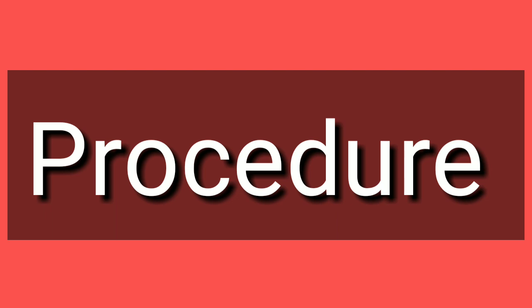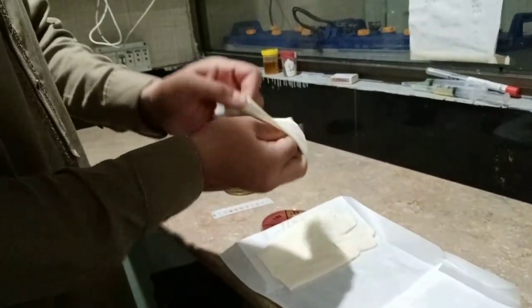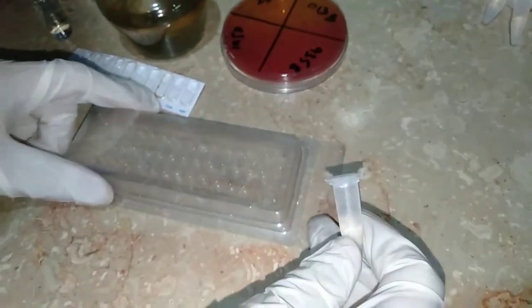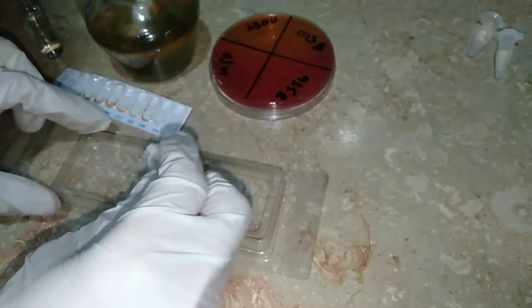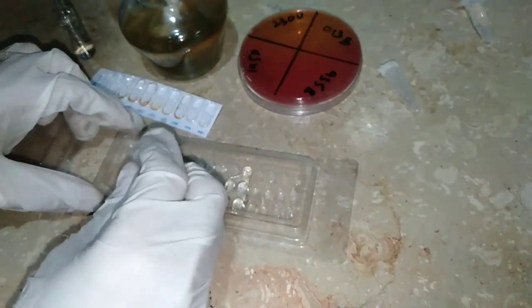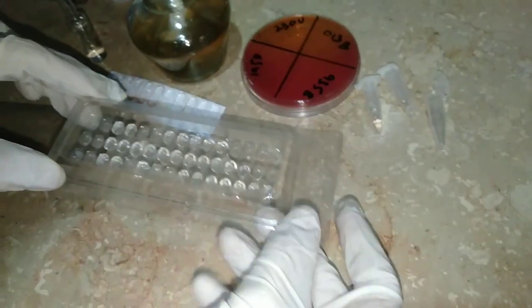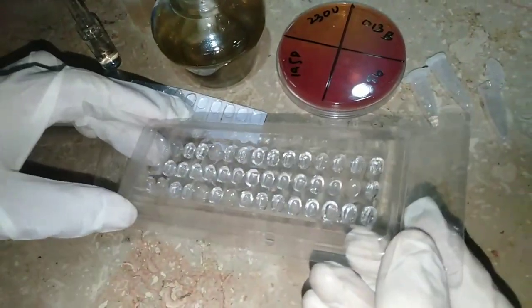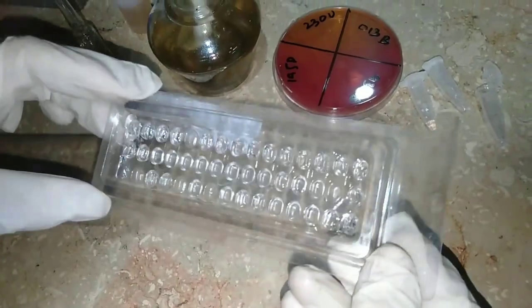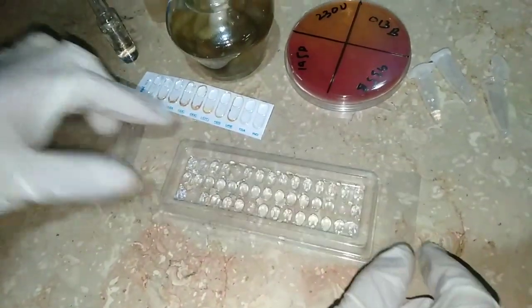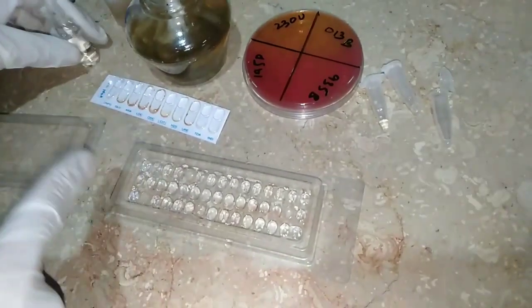First of all, we will wear gloves. After that, we take the distilled water present in the pen-drop tube and load it into the API tray wells. We are loading it now. After that, we shake it a little bit so the wells in the tray will be filled up with water, as you can see.